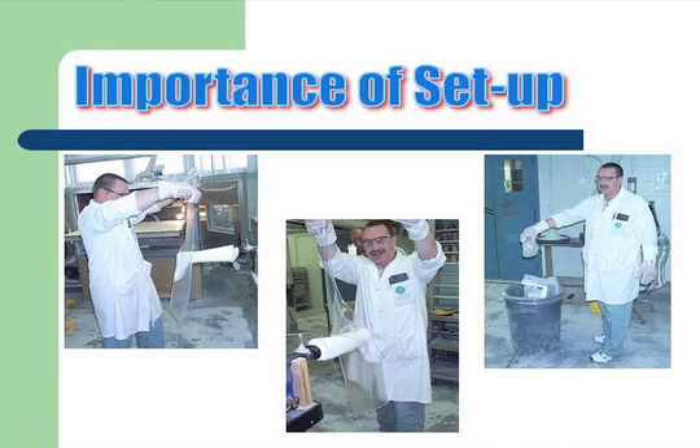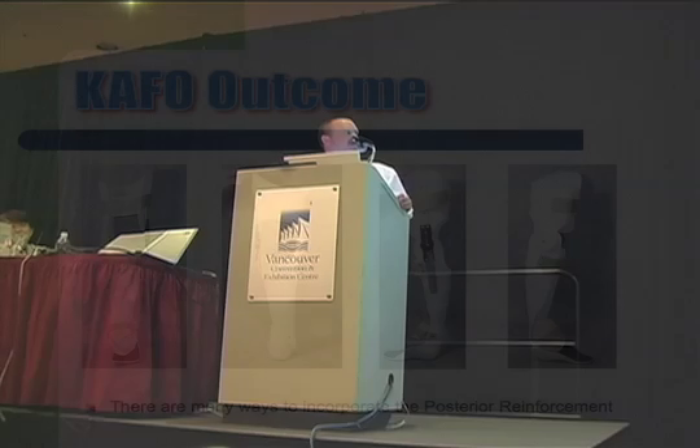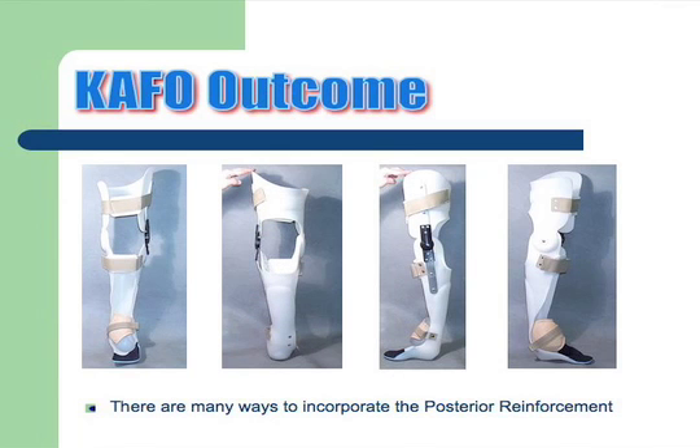This is a double mold of the KAFO we set up with a reinforced ankle on it. This is our finished device for our KAFO — it's reinforced and we double mold to get that lateral joint.